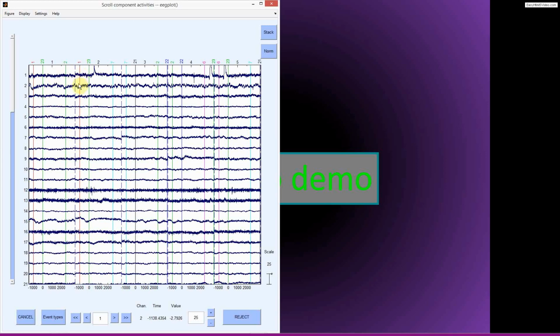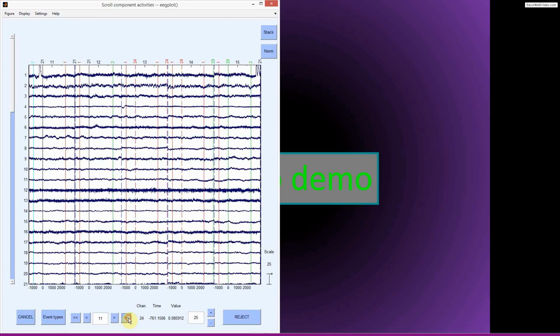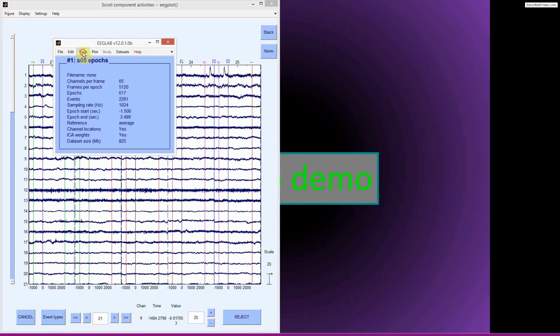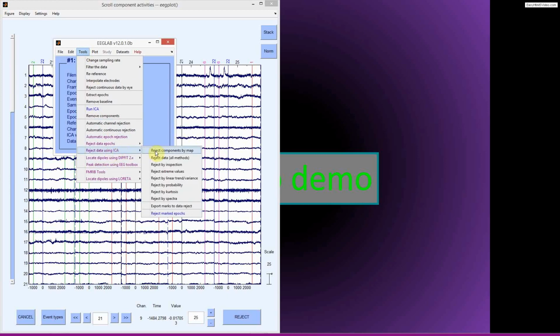We know that these are ordered according to the amount of variance explained. And so component 4, this line seems very flat relative to 3 and 5. So this already is a little bit suspicious. This suggests that there's going to be some big spikes later on. And here with 12 and 13, this also looks suspicious. We can see a lot of EMG activity, a lot of high frequency dynamics that are ongoing. And of course, these are trials, so we can scroll through the data and see what the components look like over time.